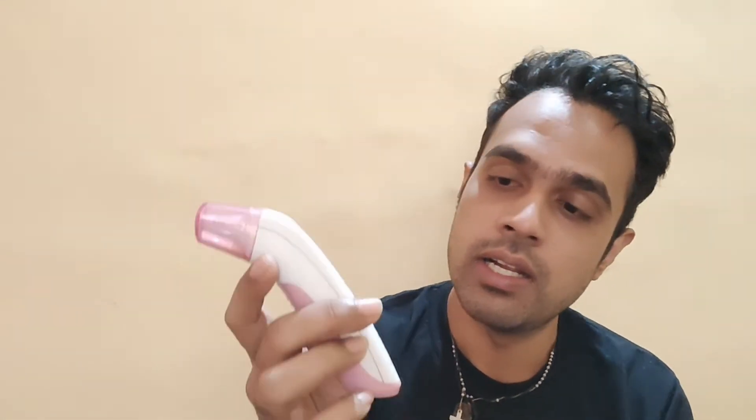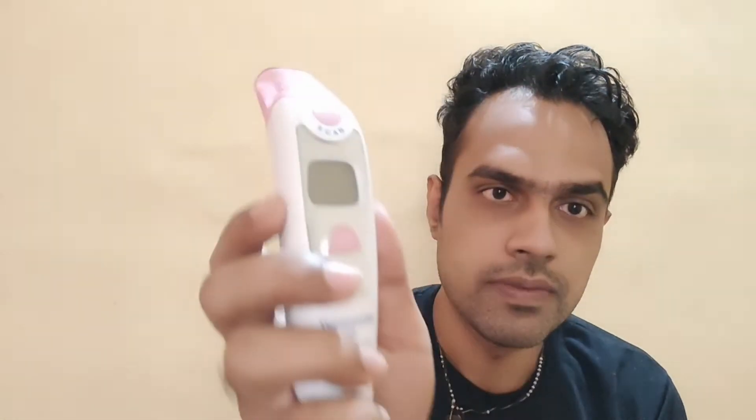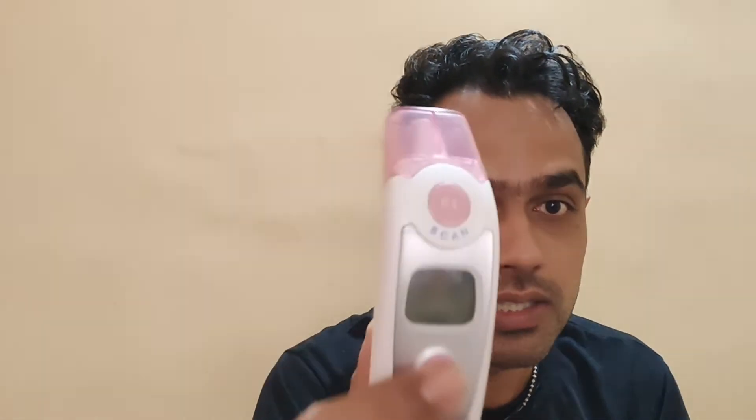Now, coming to how to change from Fahrenheit to Celsius or Celsius to Fahrenheit on this BPL AcuDigit thermometer. When the thermometer is off and showing blank, you need to hold the F2 button — like you did for memory — but hold it a little longer until you start seeing the Fahrenheit or Celsius symbol on the display.